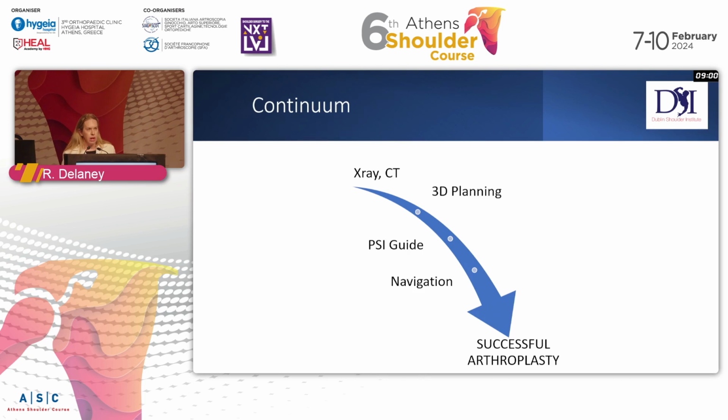But, you know, in reality, we've always had pre-op planning to a certain degree. Every one of us pre-op planned even before the software was there, in terms of spending time looking at imaging, looking at the x-ray. Getting a CT had probably become pretty standard of care for most of us before the 3D planning software has evolved. And now we have all these add-ons as well, and you can jump off of this continuum at any point.